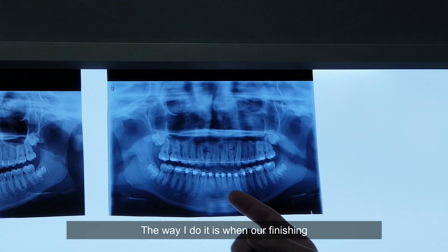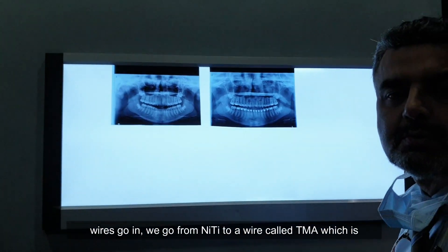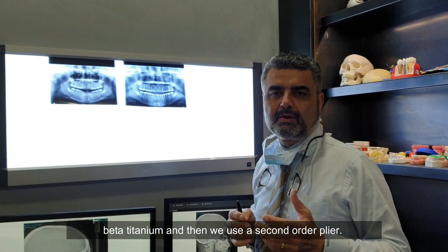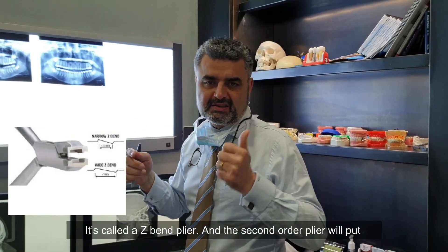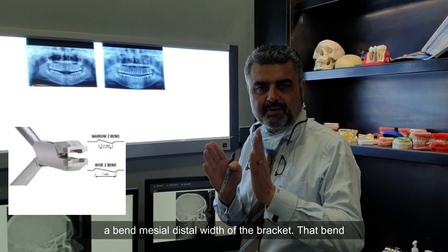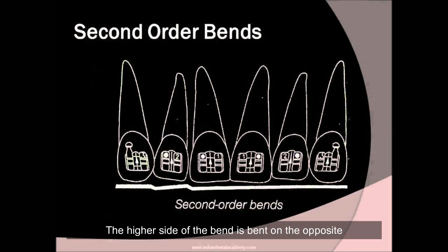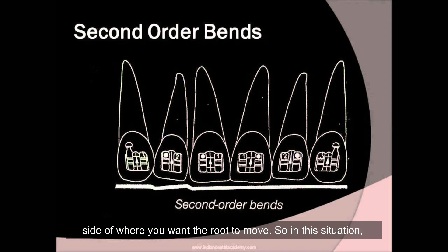The way I do it is when our finishing wires go in, we go from niti to a wire called TMA, which is beta-titanium, and then we use a second-order plier called a Z-bend plier. The second-order plier will put a bend mesially or distal width of the bracket. That bend will allow me to move the root. The higher side of the bend is placed on the opposite side from where you want the root to move. So in this situation, the high side of the Z-bend would go mesially if I'm moving tooth one-two.